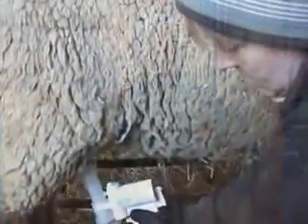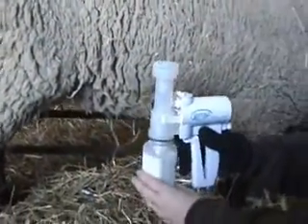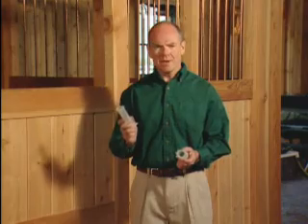The Utterly Easy milker works effectively on a broad range of species. Use the small cylinder to accommodate small or maiden mares, llamas, sheep, goats, or miniature cows. Use the larger cylinder to extract milk from mares suffering from mastitis or for large breed mares. The Utterly Easy milker has also been shown to work effectively on certain exotic species like zebras and camels in zoos and other controlled environments. When it comes to obtaining equine milk and colostrum, nothing's easier than the Utterly Easy mare milker. Here's Buck Wheeler to demonstrate.